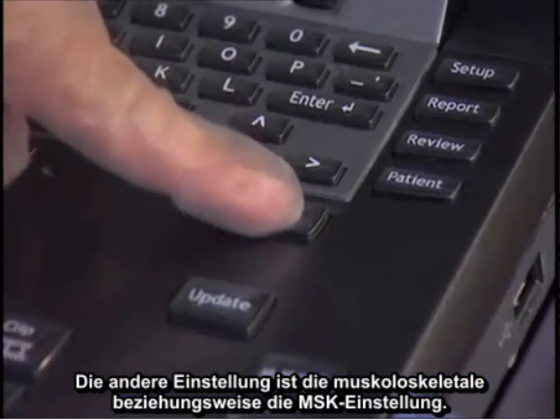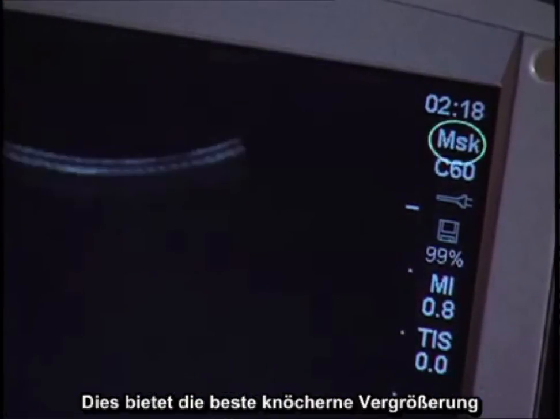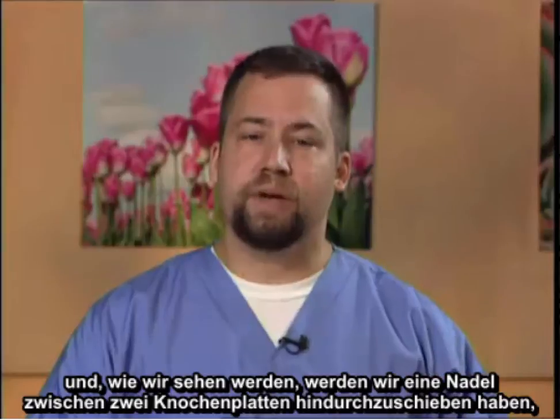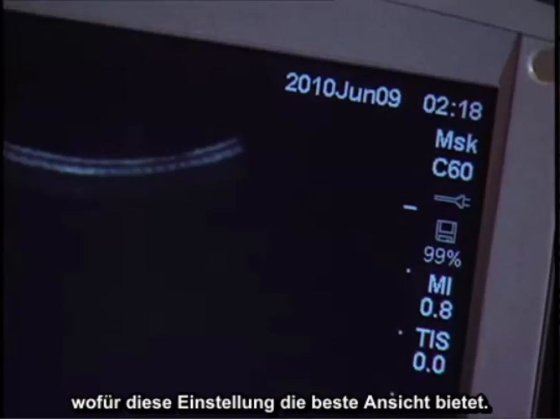The other setting is the musculoskeletal setting, or the MSK setting. This provides the best bony enhancement, and as we'll see, we'll need to be passing a needle between two bony plates, and this setting facilitates the best view of this.